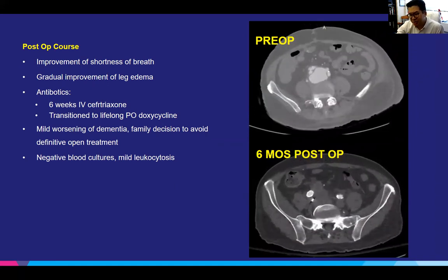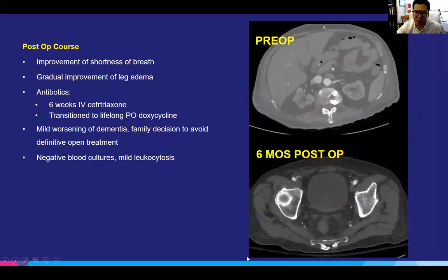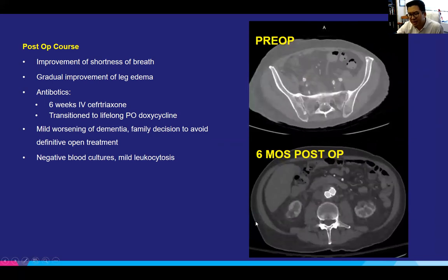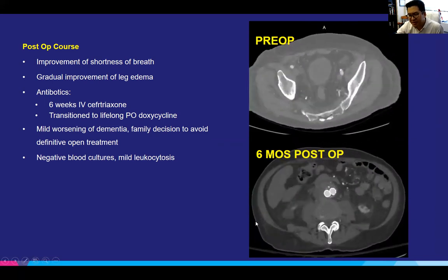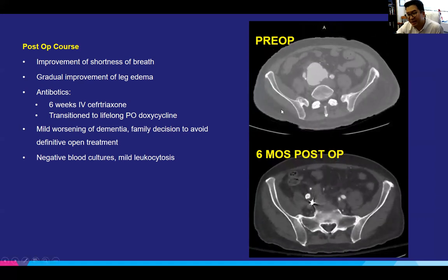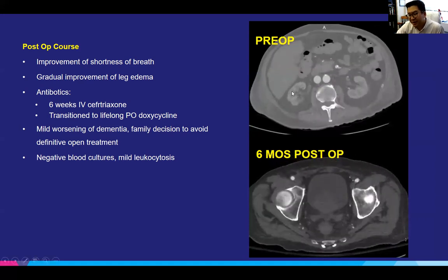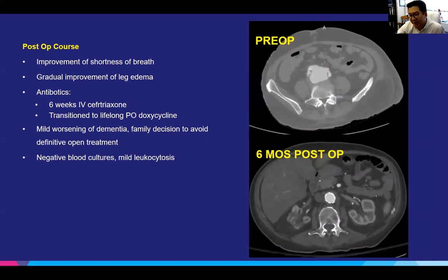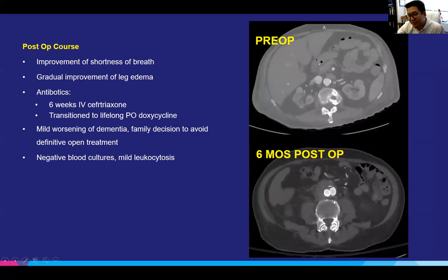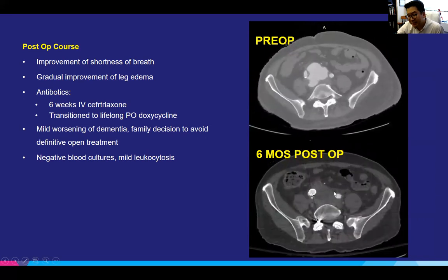The patient followed up with us for a six-month follow-up CAT scan and has been doing okay — negative blood cultures, mild leukocytosis, but slowly getting up and moving around better. When you look at the CAT scan, you no longer see that early filling of the venous system. However, when you come down to the iliac system, you do still see some remnant of the sac that was there before.